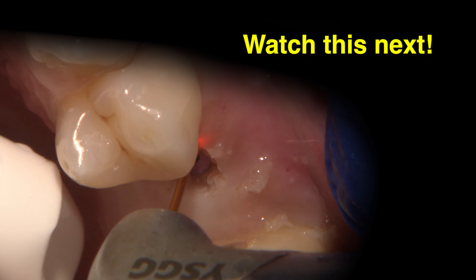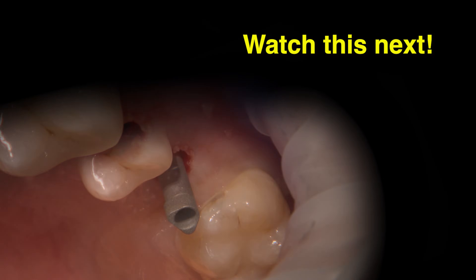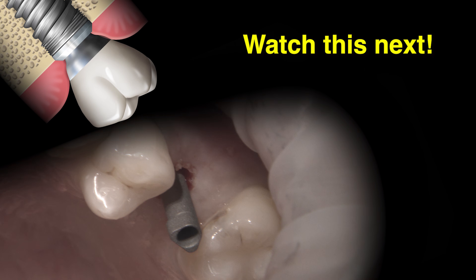Once the implant is uncovered and the tissues are properly recontoured, the cover screw is removed and a Hahn ScanBody is placed. My plan for this restoration is a screw-retained crown.